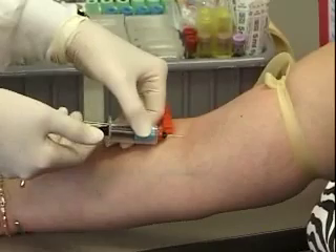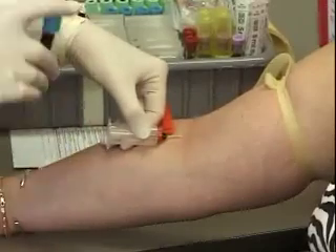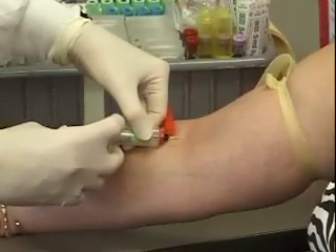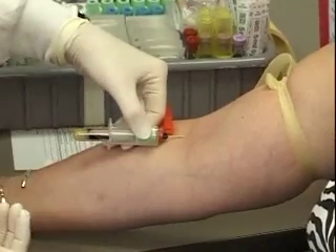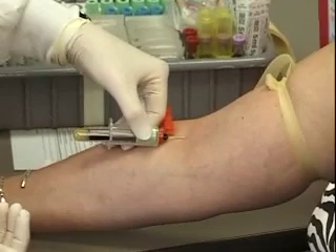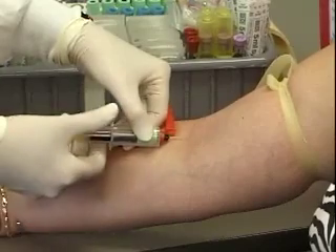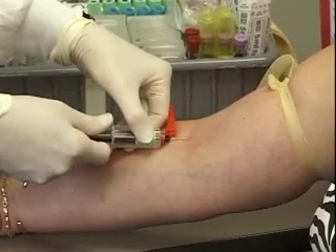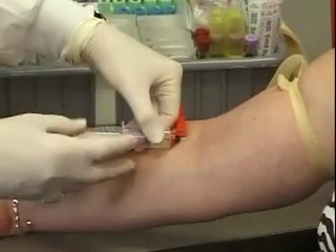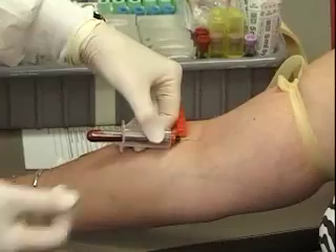At this point I'm going to let the tube fill automatically until it actually stops. The blue top tube is the only tube that has to be full, and that is because of the anticoagulant ratio in the tube. You want to make sure you mix it well. Pick up your other tube, push it onto the holder, and let it fill naturally. When you pull the tube off, make sure you're not moving the needle in the patient's arm. This is going to be my last tube — it's a 3 ml tube, so it will not fill totally up.